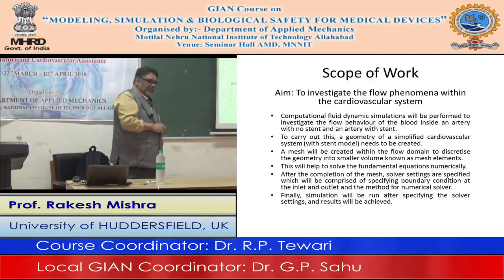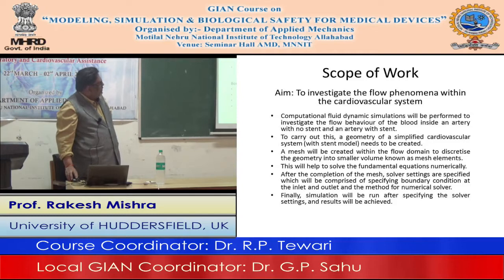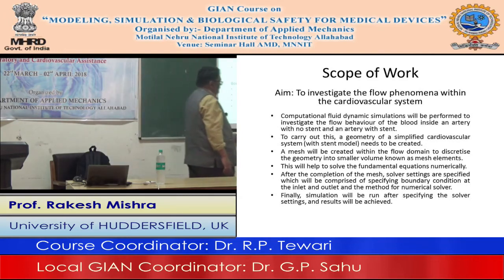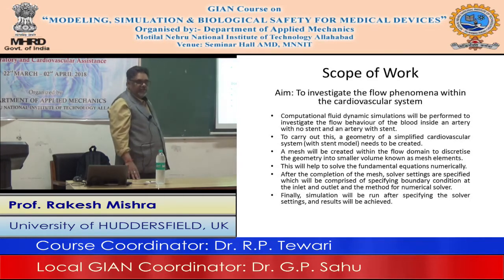It affects the flow itself, that we'll study. But apart from that, we'll be running two different types of conditions. The first thing is we'll run a steady state simulation with inlet pressure here of 3000 pascals, but then we will try to vary the pressure using a user-defined function.